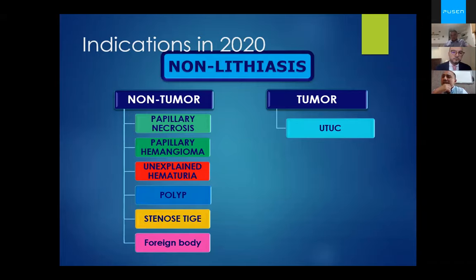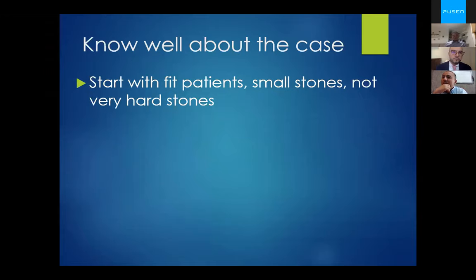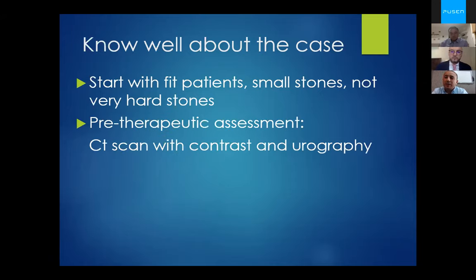After the indications, we must know the patients and the case well, and select them well. We must start with fit patients, small stones, not very hard stones. We must do a good pre-therapeutic assessment with a necessary CT scan with contrast and urography.